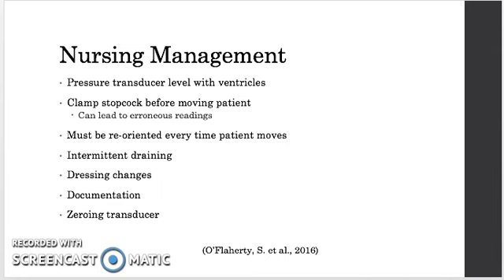Documentation is really important for this. Documentation and communication with other nurses is so important. It's key to reducing pressure and preventing complications. So for this reason, it's essential to get to know the patient, establish a baseline, and really be familiar with what their range is for ICP.